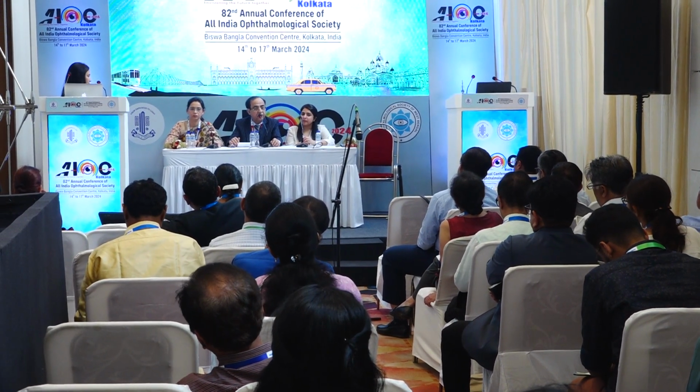That was a very nice presentation, giving a brief overview about the machine, needles, and the chopper. Just a few comments. Whenever the angle of tip is more, the cutting is better. So that means a 45 degree, 60 degree tip, when you mark to make a trench, will cut better.